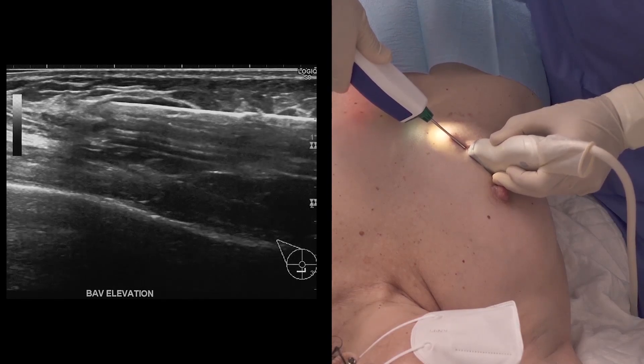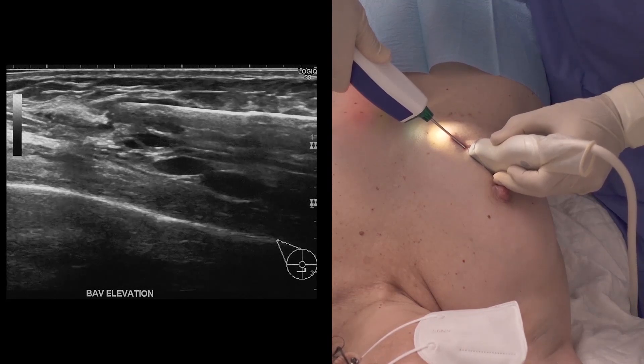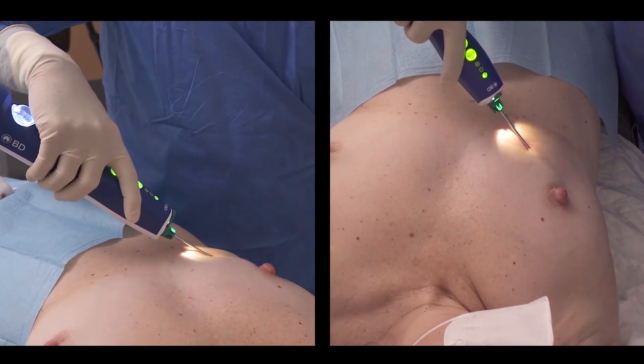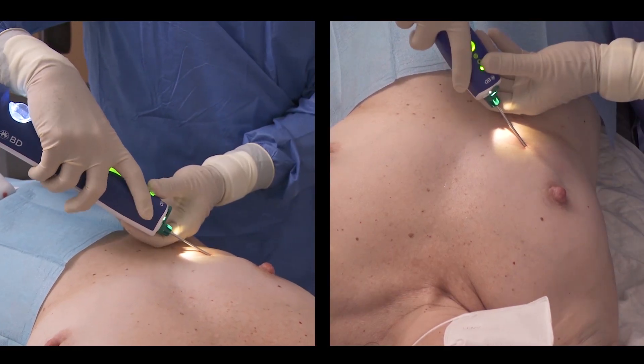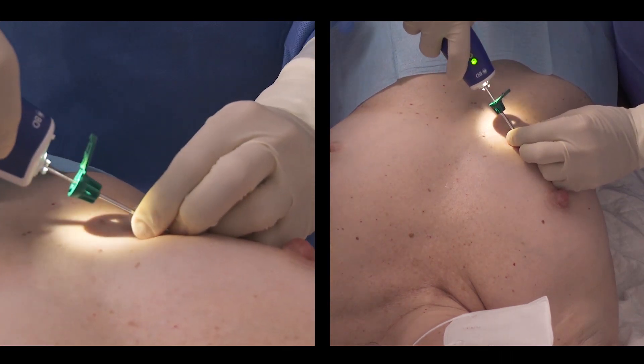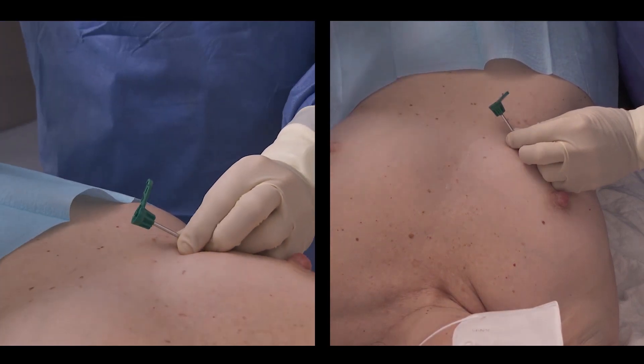A tissue marker is needed in this case. The probe must be removed while keeping the coaxial cannula in place to facilitate insertion of the tissue marker applicator. Push the coaxial arm and twist the coaxial hub to detach the probe from the coaxial cannula, then remove the probe.